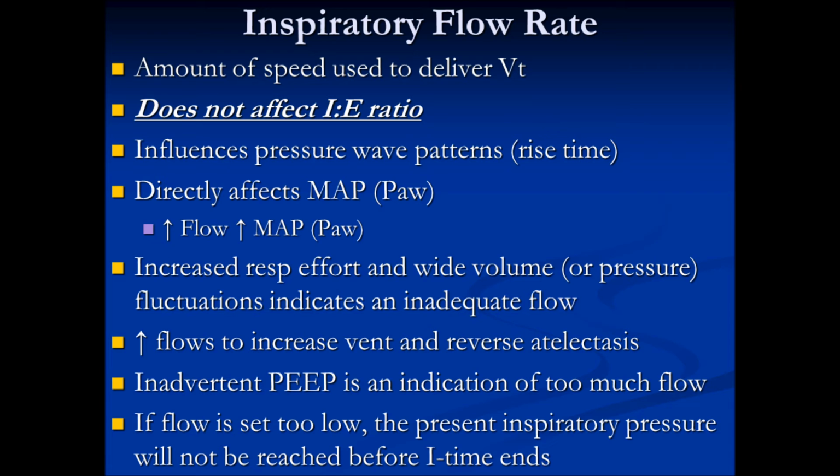You need enough flow in order to get to the set pressure. So that's a troubleshooting technique here. If you notice that the machine is not able to get to the set pressure with each breath before it cycles into expiration, it's because you have the flow set too low.